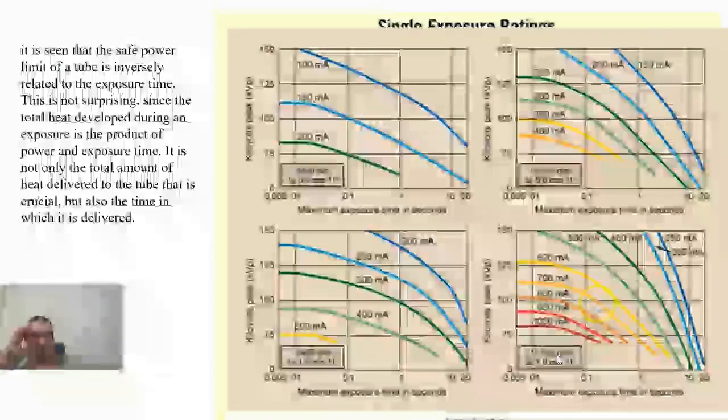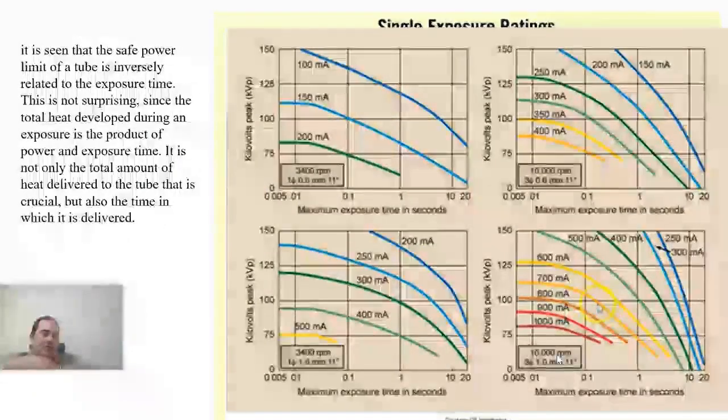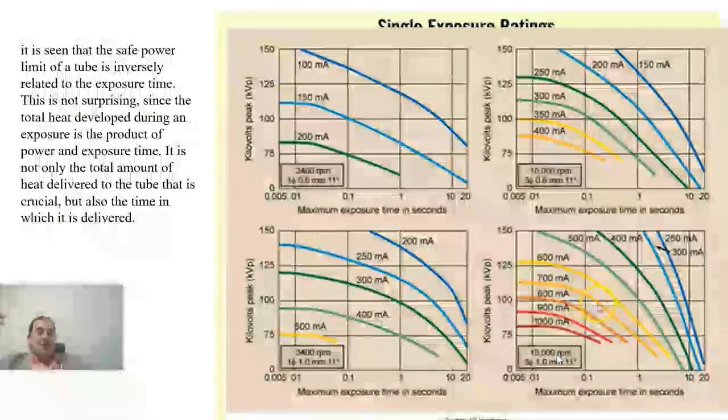Let me say, there are two schools of thought. Today, for example, I want to work on a scan like a cardiac exam. I have no problem with the patients. I'm speaking in terms of market language. They might say that the patient dose is not an issue for me. The important thing is to increase the parameters.